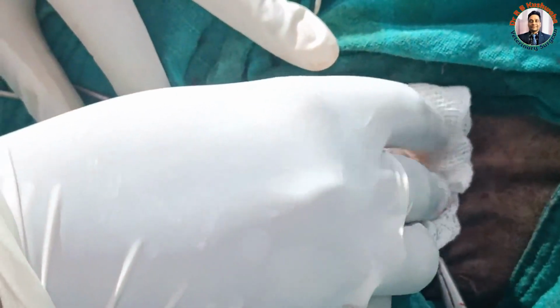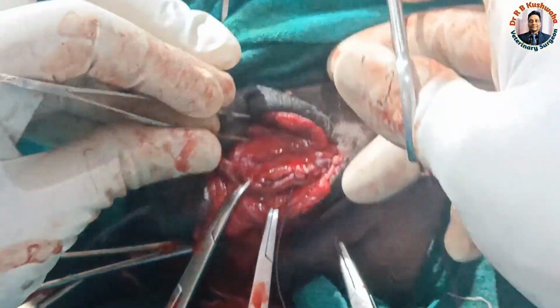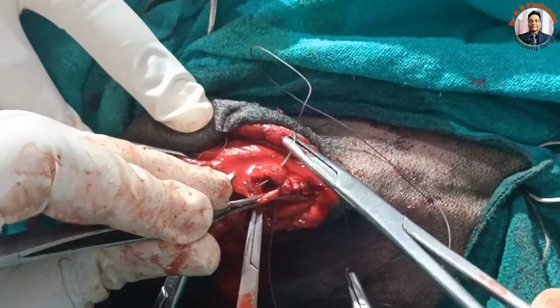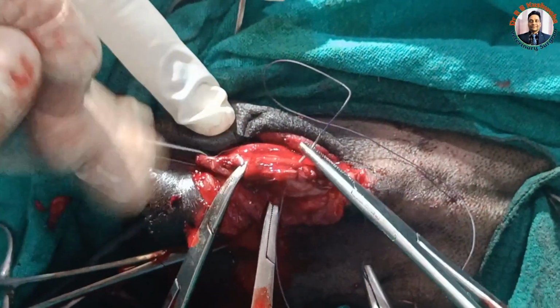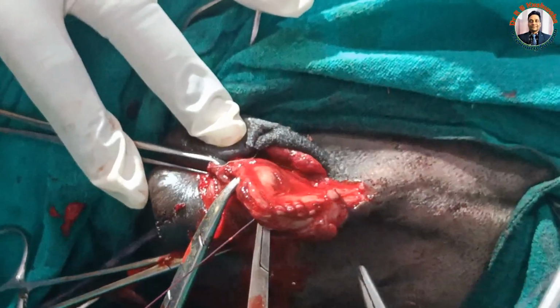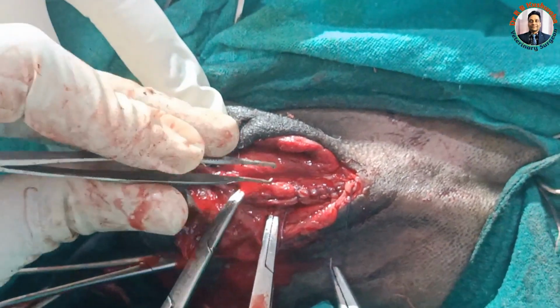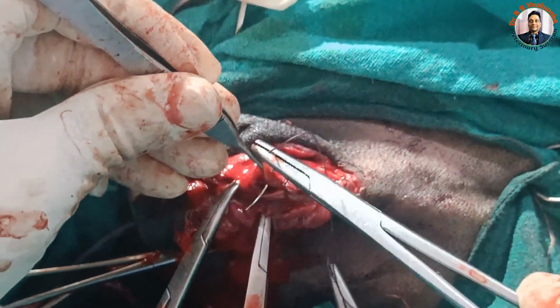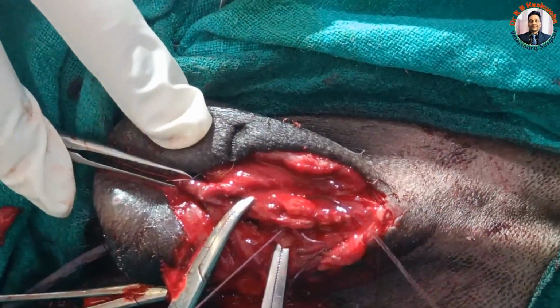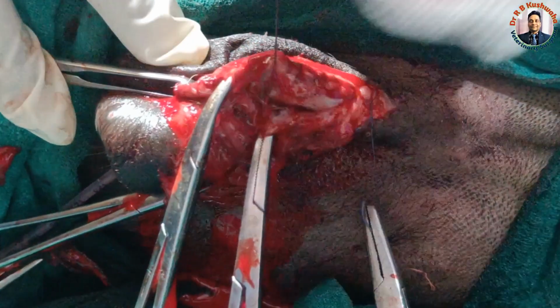Mop it. So mild oozing of the blood is continuous because we are working in the urethra, and you know there is always oozing of blood from the urethra. Mop it.